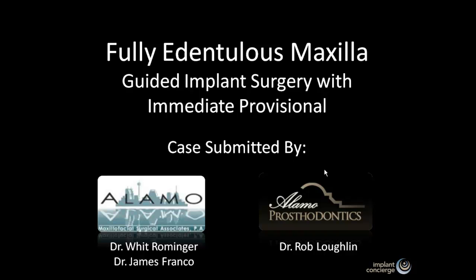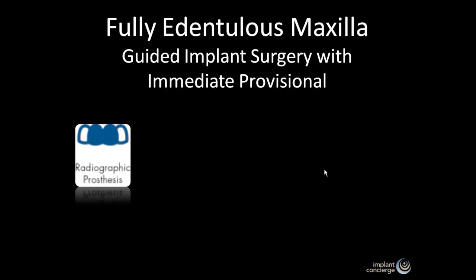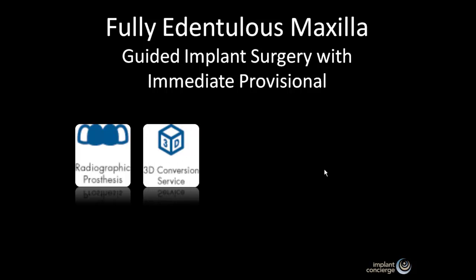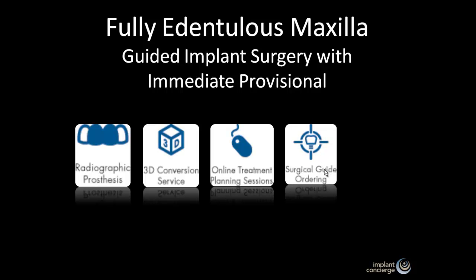The following steps and protocols to complete a fully edentulous maxilla guided implant surgical case with immediate provisionals are: first, create a well-fitting radiographic prosthesis. Next, acquire a 3D CBCT scan of both the patient and radiographic prosthesis, and then convert the 3D DICOM data into the Nobel Clinician software. The next step will be to finalize the treatment plan during an online treatment planning meeting with the laboratory, surgeon, and restorative dentists. Once the treatment plan is complete, a computer-generated surgical guide will be ordered and delivered directly to the laboratory for the final step before surgery, which is to create the provisional restoration.